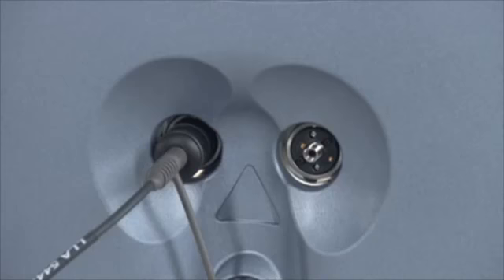The laser console is equipped with dual fiber receptacles, allowing you to connect one or two delivery devices to the laser. When connecting two delivery devices, the devices must be of different types. For example, an Aculite endoprobe and a laser link, or a laser link and an LIO.